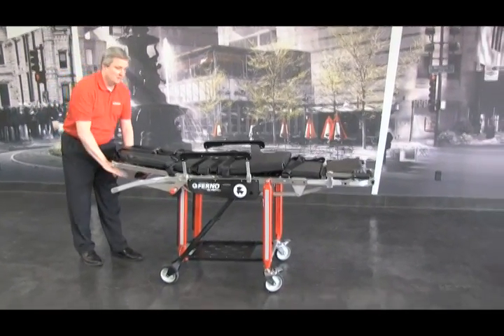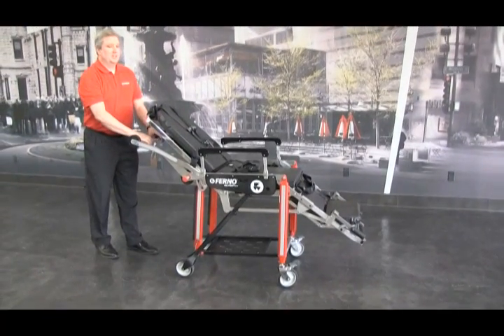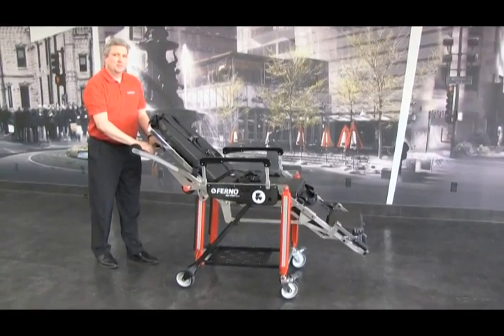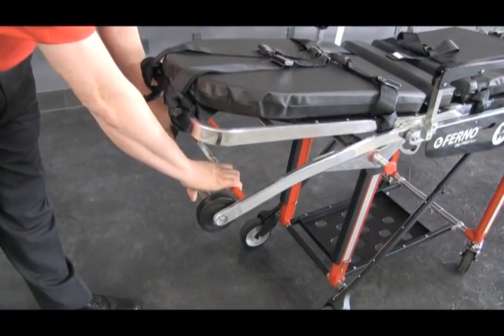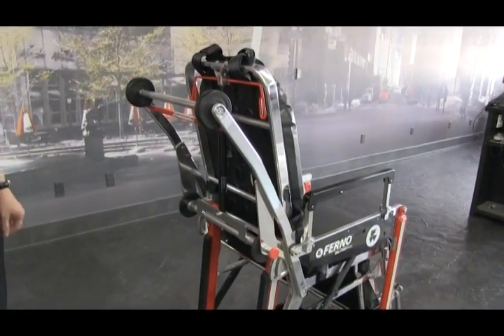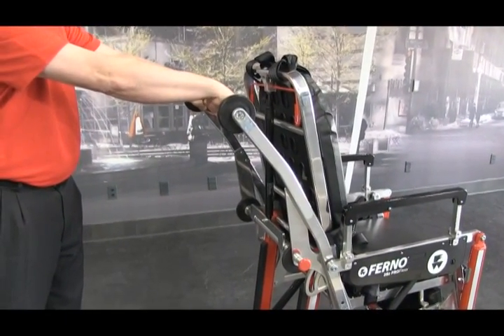There's an intermediate position between the two. If you need to get to a tight area but don't need to go all the way into the chair position, push down the cot a little bit to assume the weight, pull the handle, and adjust into position. Assume some of the weight and pull the handle.